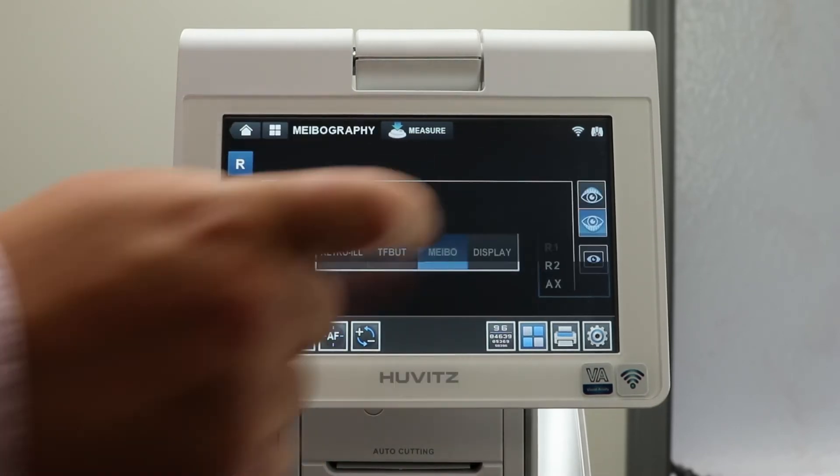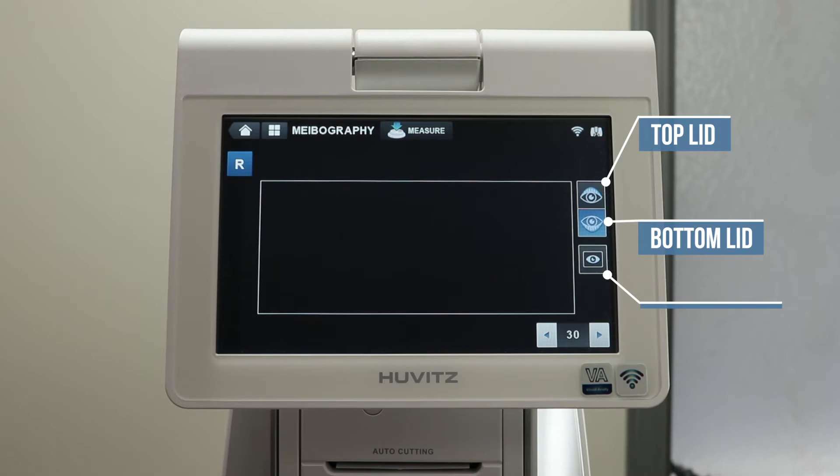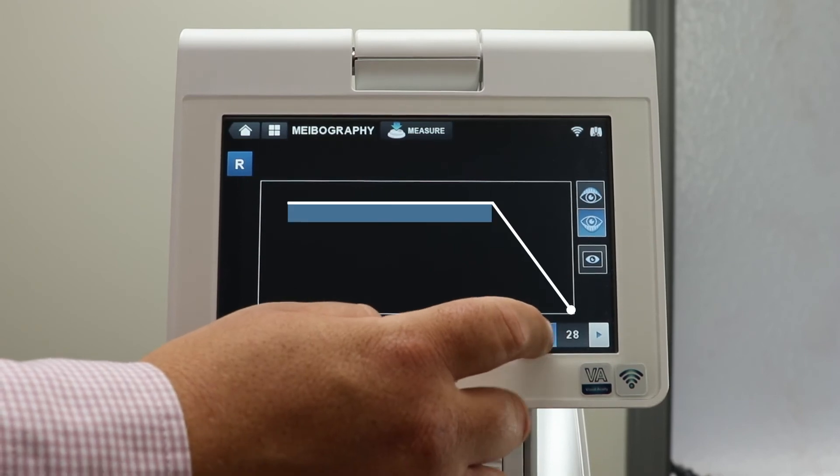Under meibography, get a clear view of the meibomian gland with the infrared camera. To the right-hand side, you will see a top lid, bottom lid, and full picture icon. Use the arrows at the bottom to adjust the brightness.